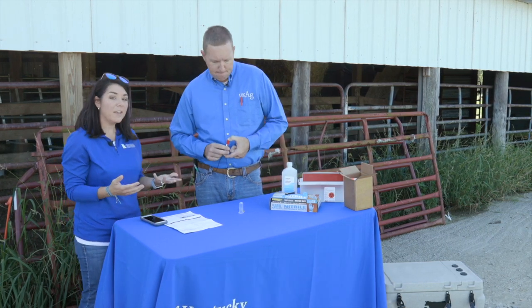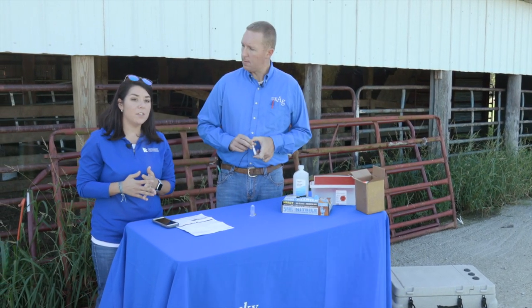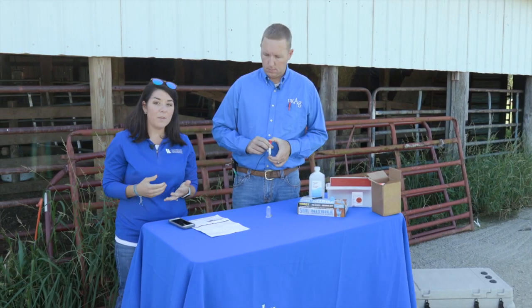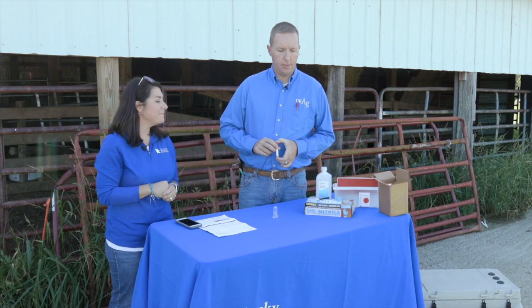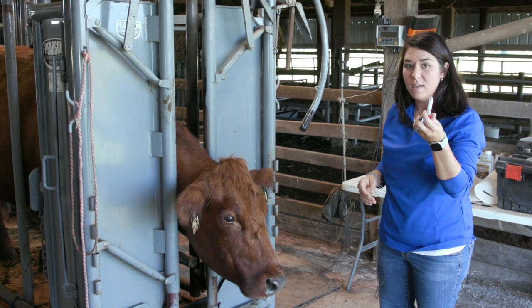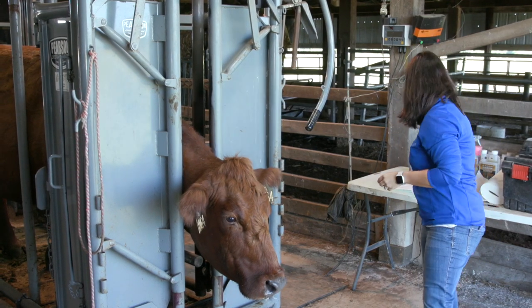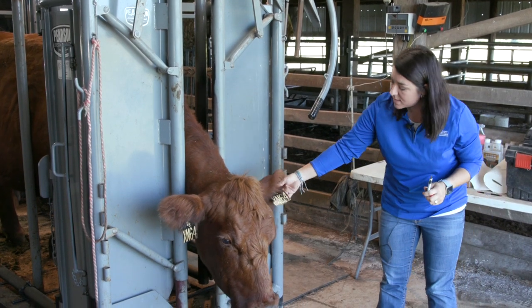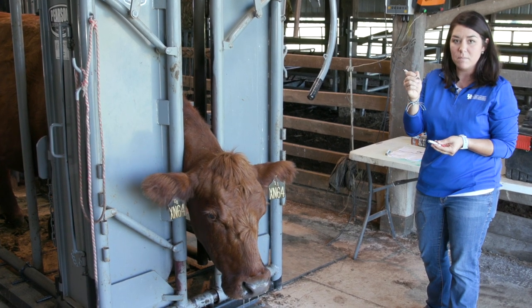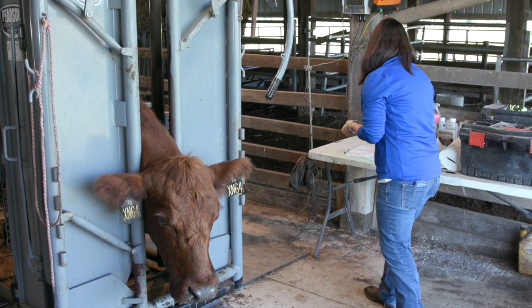This is a neat thing you can do to help maximize profit on your farm, and after this demonstration we hope you'll be able to do it confidently. Now for the demo: I'm using the tag number — in this case XN64 — and corresponding it with the pregnancy test tube number, writing it on both the tube and the record sheet. Use a ballpoint pen or slim Sharpie for good legibility.